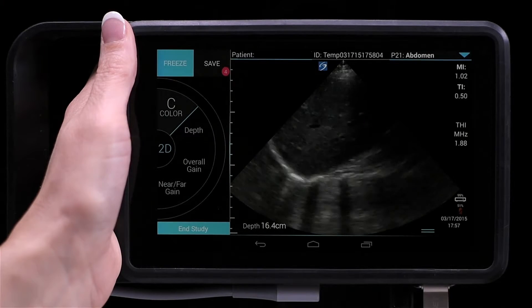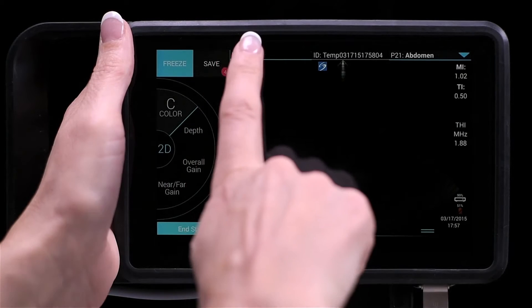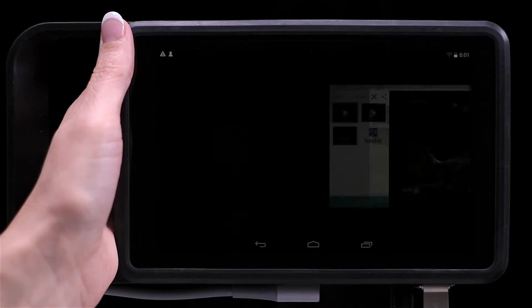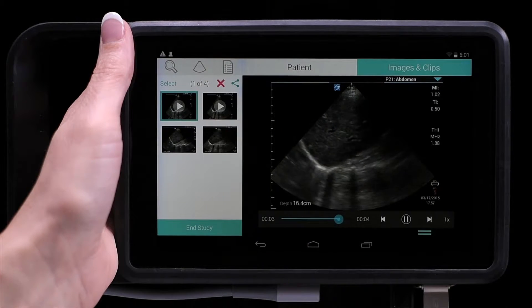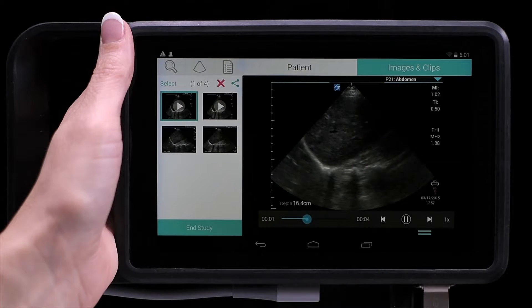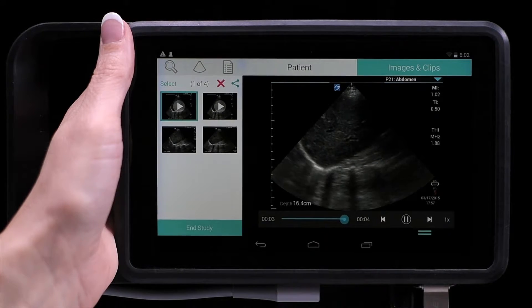To review the current study, tap the patient field and a list of image and video thumbnails will appear. Tap the arrow to play a video.